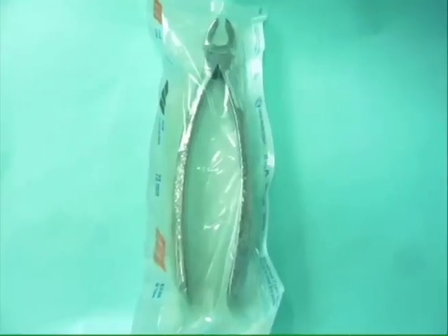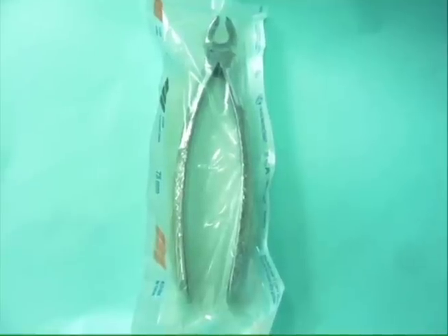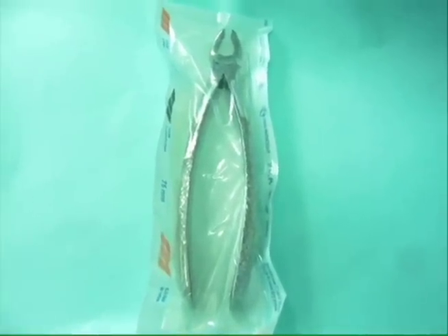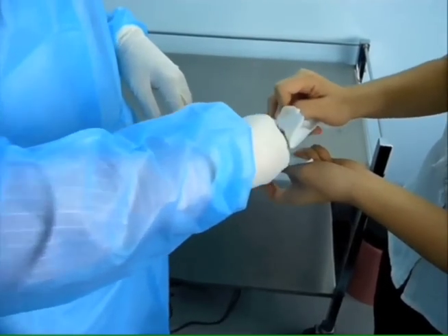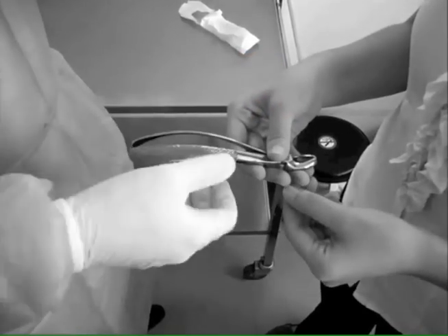Passing of packed sterile instruments. While passing packed instruments, the assistant should open the pouch without touching the instruments or the inner surface of the pouch. The instruments are handed over with the handle facing the dental operator. The assistant should not touch the instruments before handing them over to the dental operator.